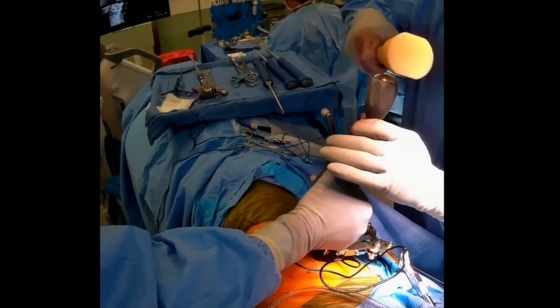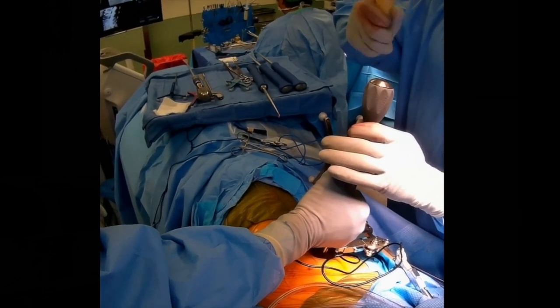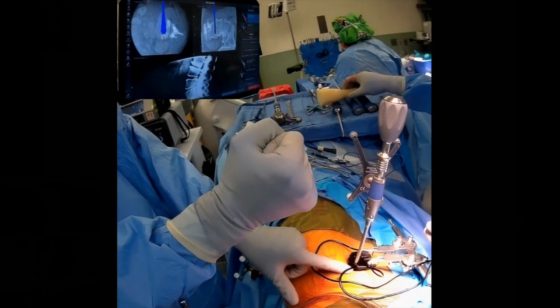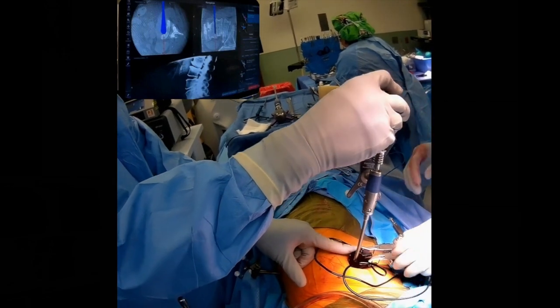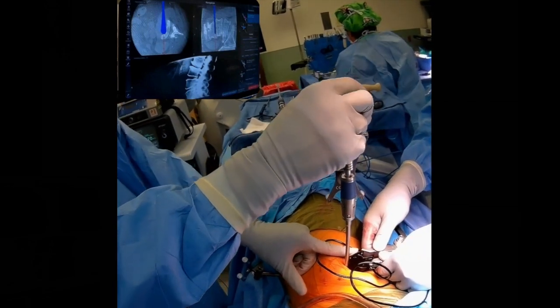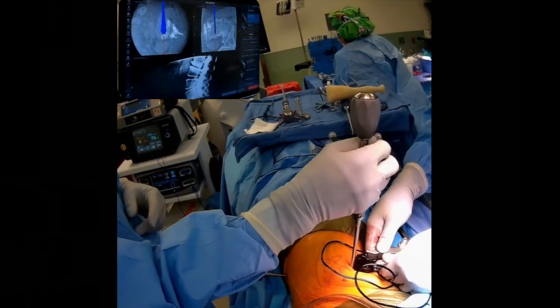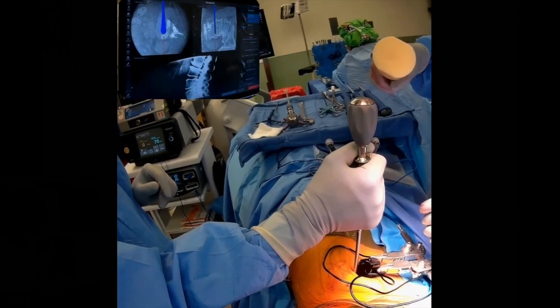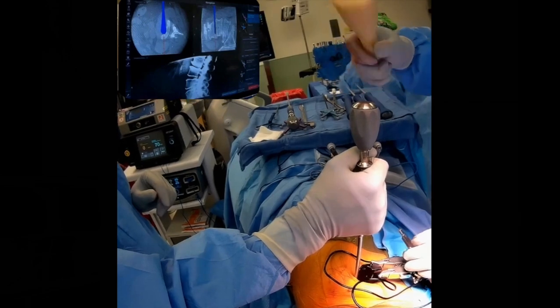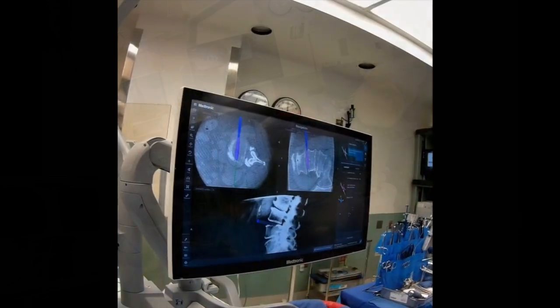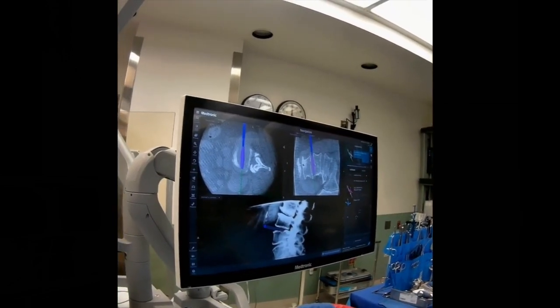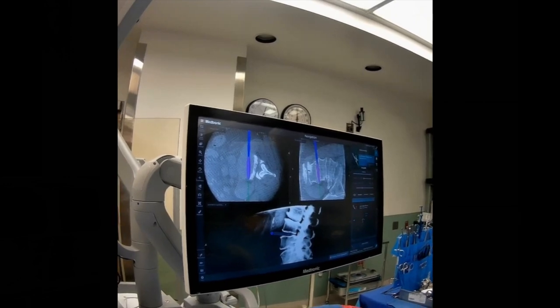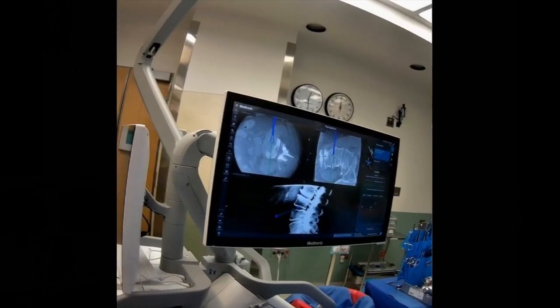Curettes are then used to loosen the disc material, and afterwards pituitary rongeurs are used to remove the fragments. A navigated cobb is then inserted in an oblique manner; after partially going into the disc space, the cobb is then rotated out of the retractor into a true lateral position. Thus, even though the surgery is performed with an oblique approach, the interbody fusion and other instrumented working tools are placed in a true lateral fashion.